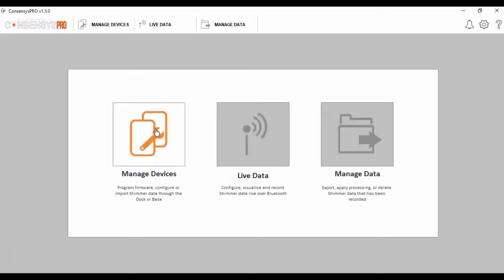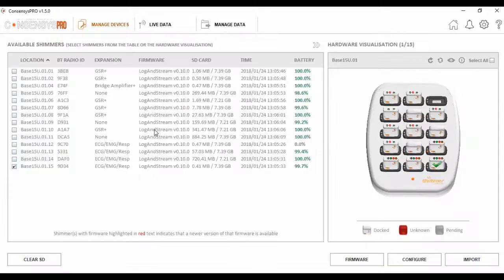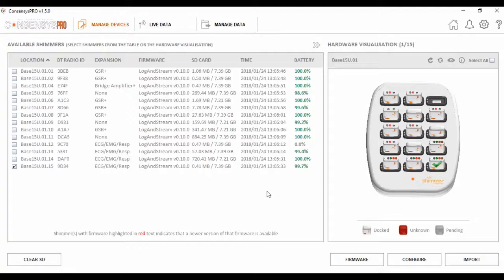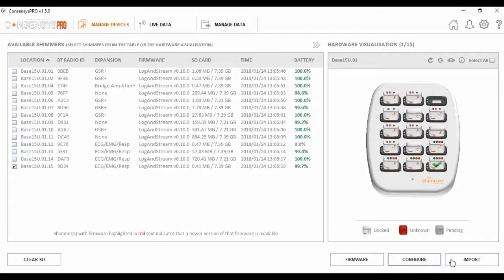The first tab is Manage Devices. This tab is essential for when you are starting your trial, as it allows you to perform a number of functions, including programming the firmware, configuring the devices, and importing the data from the device's SD card. All these functions should be considered before you start collecting data.